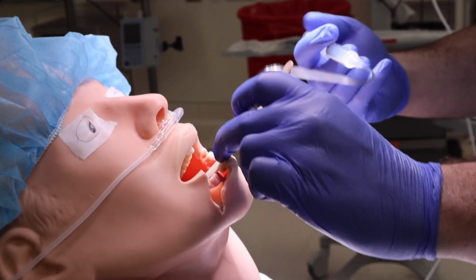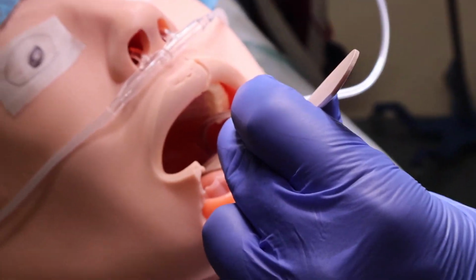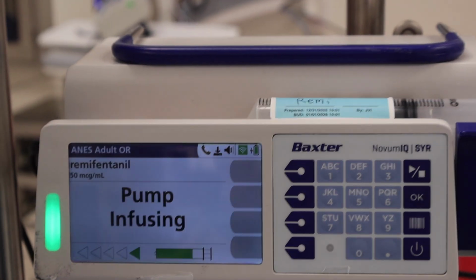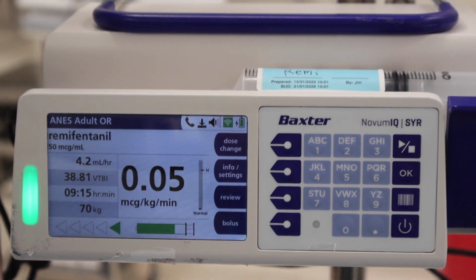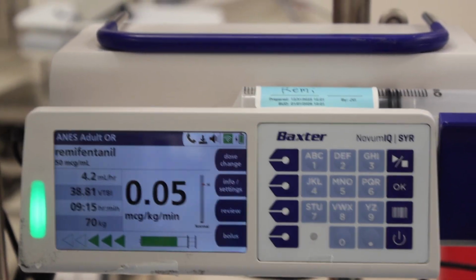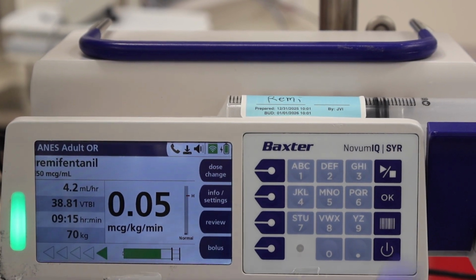At 5 minutes before intubation, repeat the 2% lidocaine atomizer application, again delivering 3 to 5 milliliters per side. This reinforces oropharyngeal anesthesia and helps suppress the gag reflex. At 2 minutes before intubation, you may start the remifentanil infusion at 0.05 micrograms per kilogram per minute if additional cough suppression and comfort are needed. Dexmedetomidine alone may be sufficient for some patients. Titrate the remifentanil carefully to avoid oversedation.